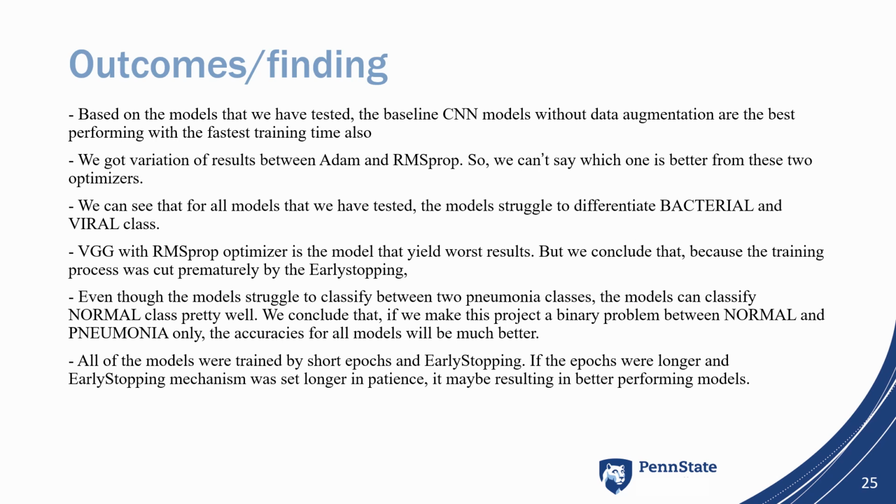We conclude that if we make this project a binary problem between normal and pneumonia only, the accuracies for all models will be much better. And the last thing is, all of the models were trained with short epochs and early stopping. If the epochs were longer and the early stopping mechanism was set with longer patience, it may result in better performing models.